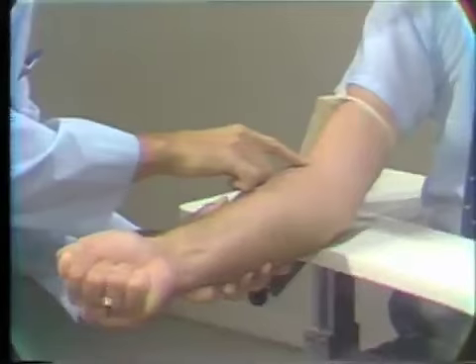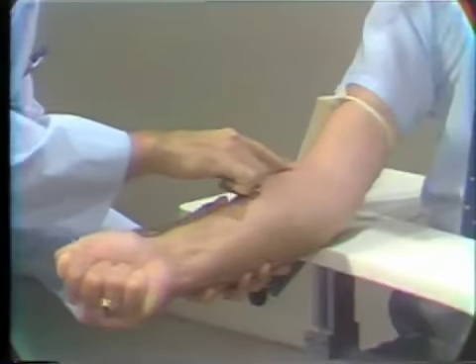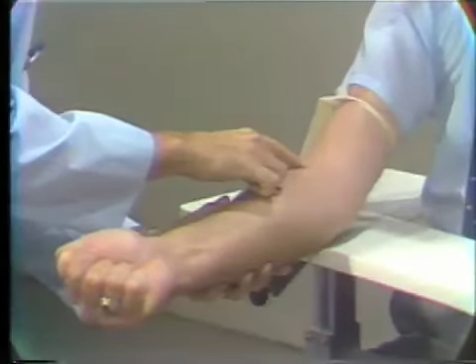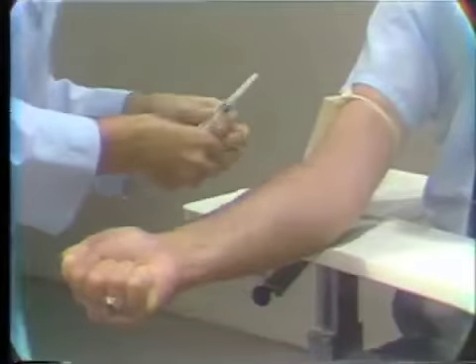There is a very large, deep vessel running right where my finger is pointing at this time. This is the vessel I'm going to go for. I can feel it doesn't move or roll around. So now I will pick up the syringe, the alcohol gauze, and the gauze that I'll use later.